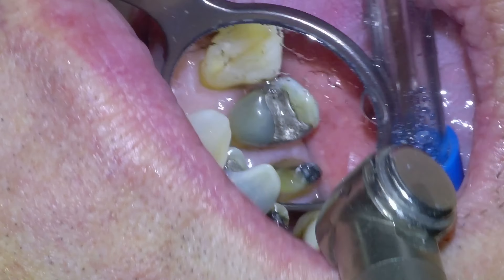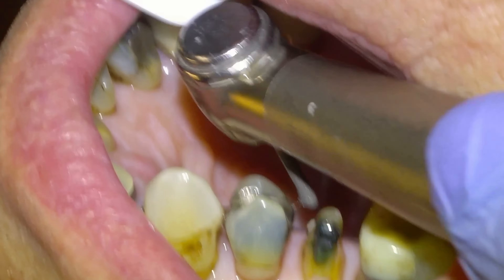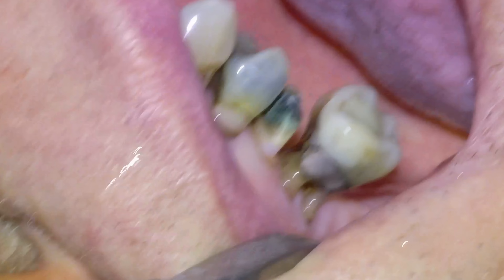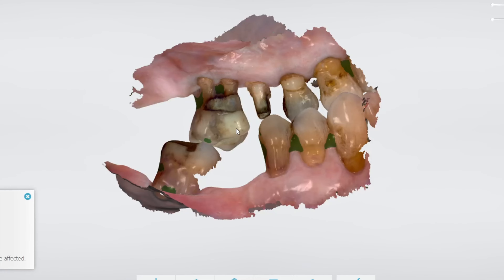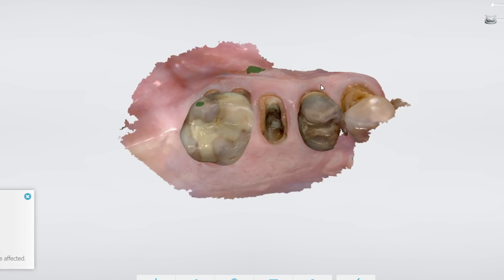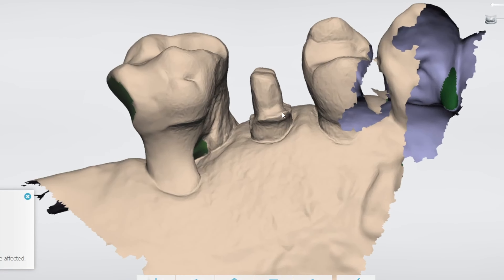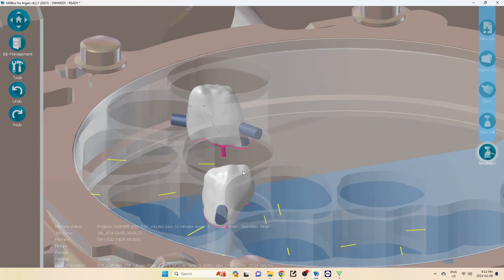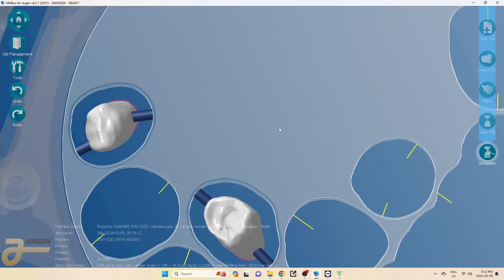Once we've done that, we're going to get our scan. We'll scan with the Trios 4 and then send it to my designer. There's the scan — they're happy with the margins and we have at least a millimeter of clearance, because we're going to be using monolithic zirconia. There's the design STL.